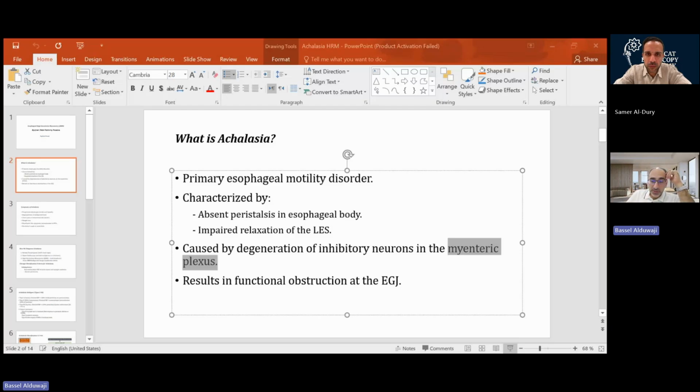And we also have to know that usually achalasia starts from tightening in the LES. When the LES starts to be tight, the esophagus starts to dilate. So in type 2, since we still have pressurization, the esophagus is still trying to contract. But because the LES is very tight, it's not opening, so the esophagus starts to dilate. Once we treat the elevation in the IRP, it can help the patient restore the peristalsis in the esophagus.